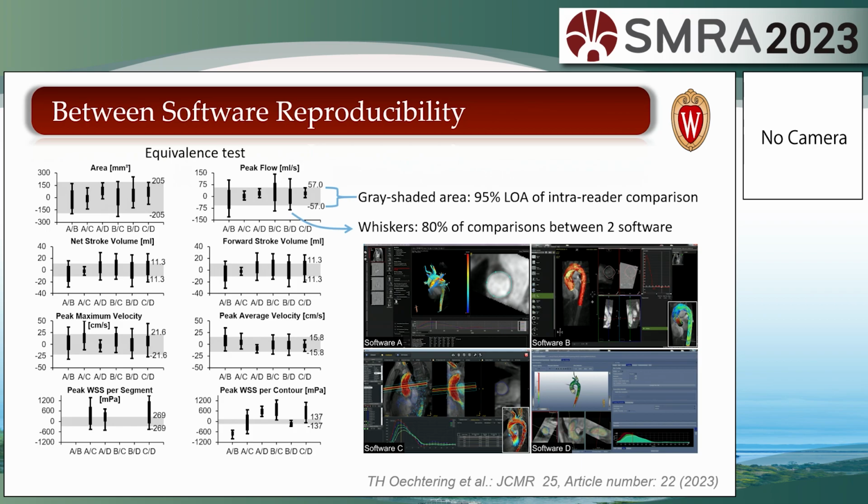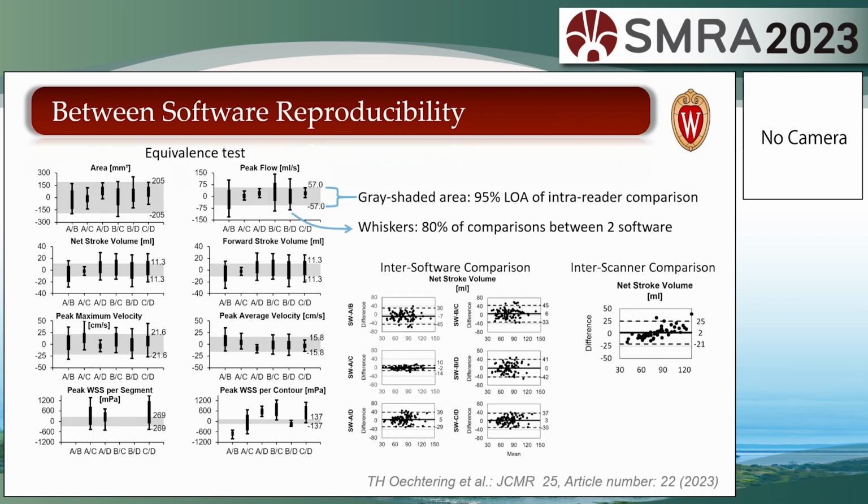There's something to consider, and that study was already cited by Susanne Schnell yesterday in one of the future talks: there are some discrepancies with analysis packages. If you use the same data with different 4D flow packages, you will not always get the same results. I think it often has to do with the segmentation engine, but it's an area where we'd like to see more consistency down the road.